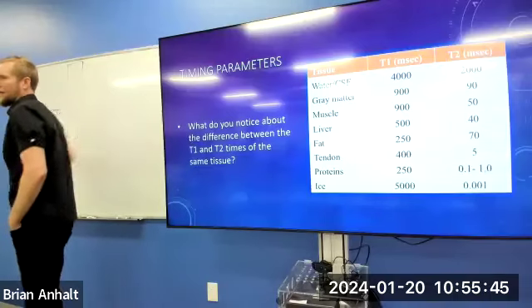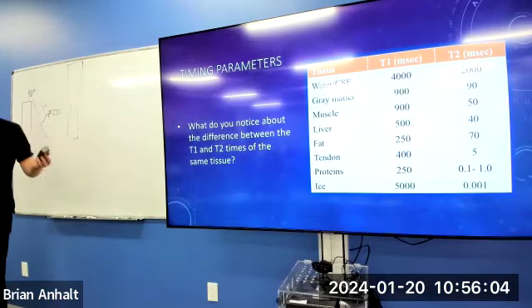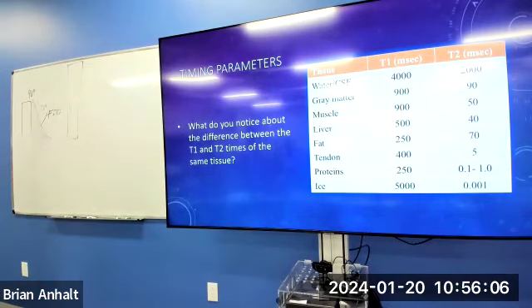You're probably looking at a different PACS system, there are so many different PACS systems, right? If it says unknown on the reading radiologist, they just didn't claim it yet, probably. Their name isn't in there yet. You'd have to look at the report. If there's a report, it's gonna say a radiologist's name on there. But maybe PACS wasn't used correctly, maybe they forgot to put their name in the system. I'm not 100% sure what you're looking at.